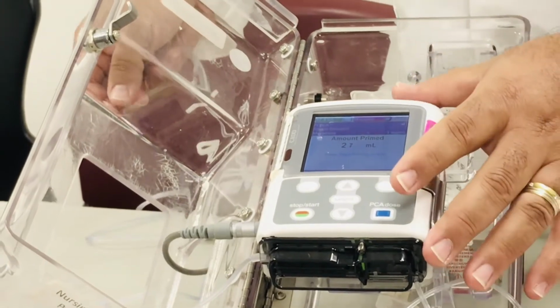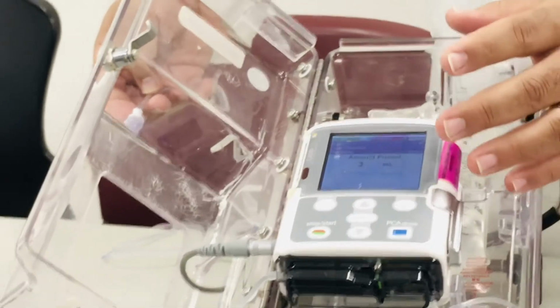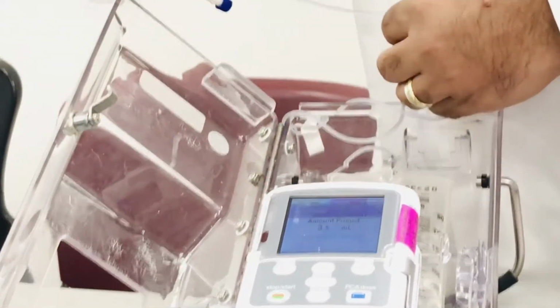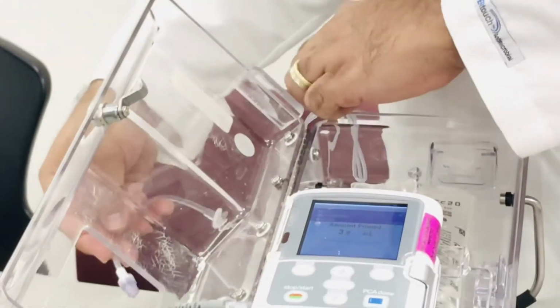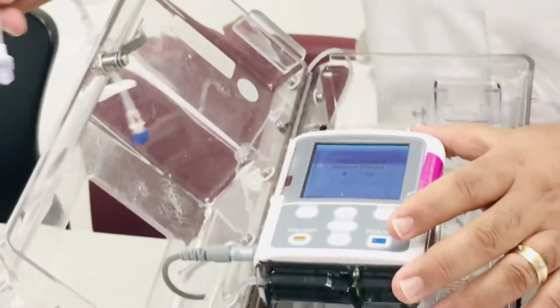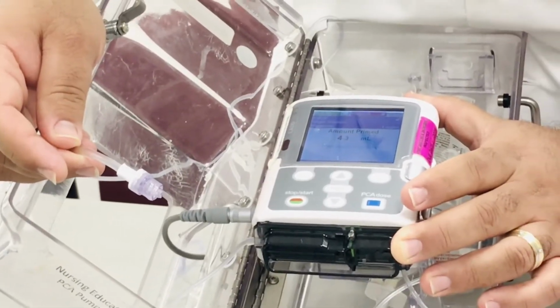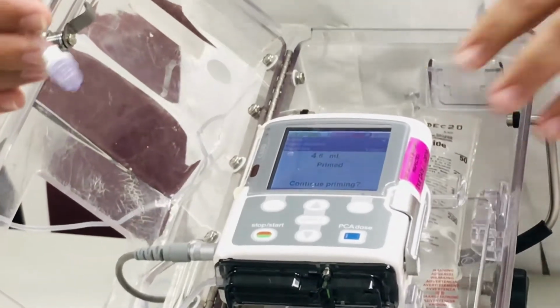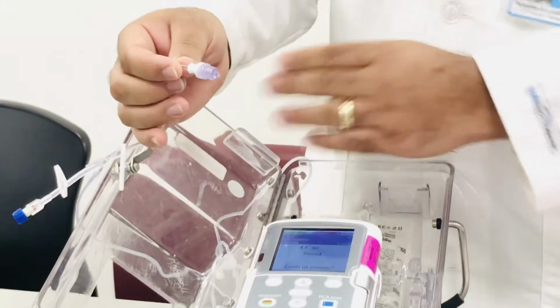It's around 4 mLs, so around the 4 mL mark, we should be paying attention to the actual tubing to make sure that the air is, and here we go, hold on 1 second, that there's a couple of drops. Once there is like 1 or 2 drops, you are going to stop priming. Okay? Now you connect this to the patient. Therefore, there's no air in the line.